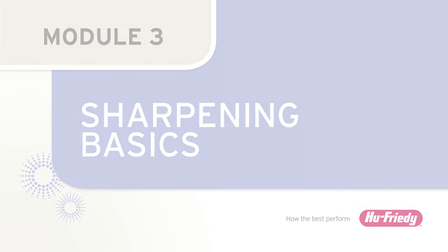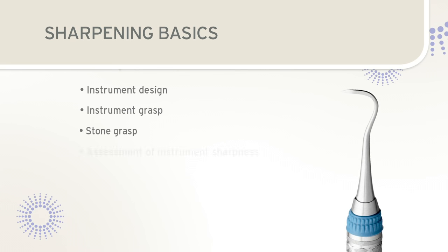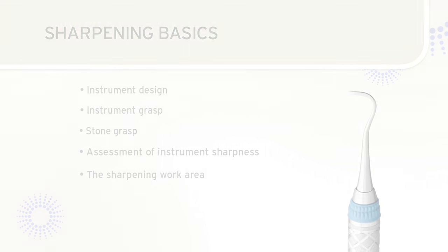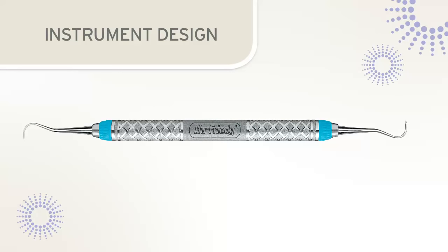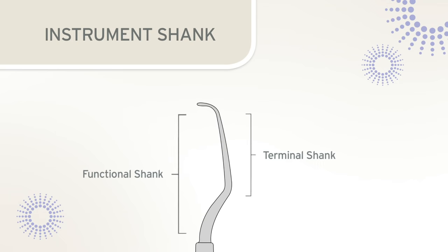Whether sharpening sickle scalers or curettes, there are basic principles to consider prior to sharpening, including instrument design, instrument grasp, stone grasp, assessment of instrument sharpness, and the sharpening work area. All dental instruments have a handle, a shank that connects the handle to the working end, and a working end consisting of a blade with one or two cutting edges. The instrument shank can be divided into the functional shank, which extends from the handle to the beginning of the working end, and the terminal shank, between the blade and the first bend of the shank.